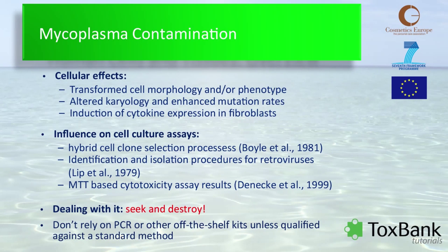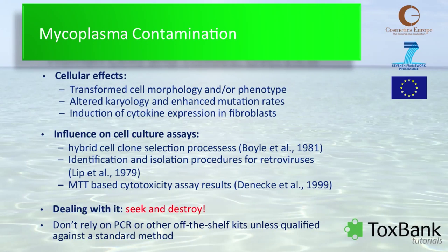The first approach to take in dealing with mycoplasma contamination is to carry out routine examination of cultures using a qualified method to detect them, and once you have detected them, to destroy them — only retaining cells which are contaminated if you have no other source of those particular cells. It's important not to rely on off-the-shelf methods unless they've been qualified against standard methodologies, particularly because the sensitivity of these methods can vary significantly, and also their specificity in that they may miss certain species of mycoplasma.